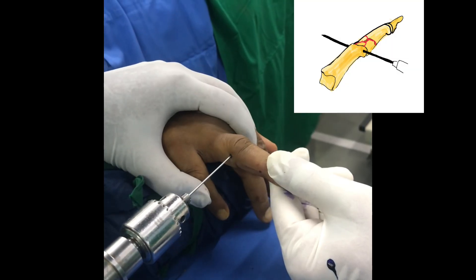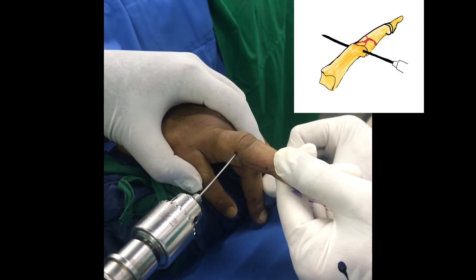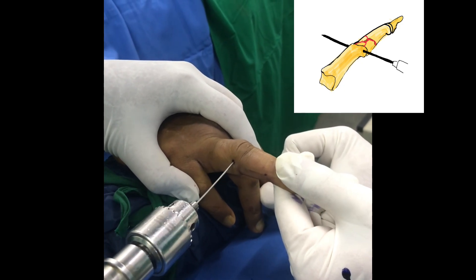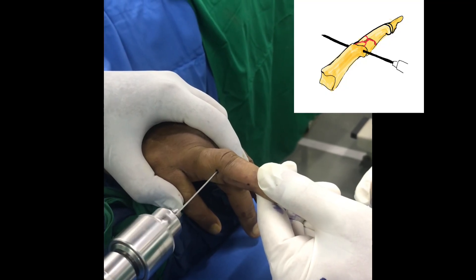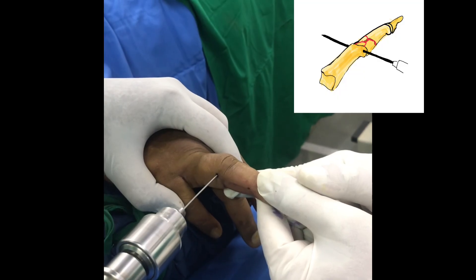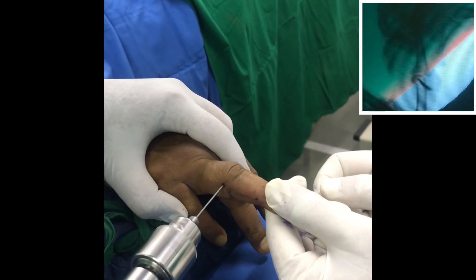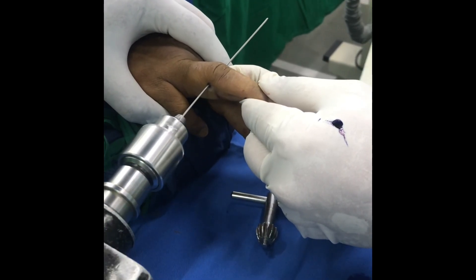The K-wire long 9-inch is passed across the center of rotation of the proximal interphalangeal joint in this fashion. This is done under image intensifier. Be sure that you are passing this wire through the center of rotation of the PIP joint, as you can see in the image intensifier image on the right hand side.